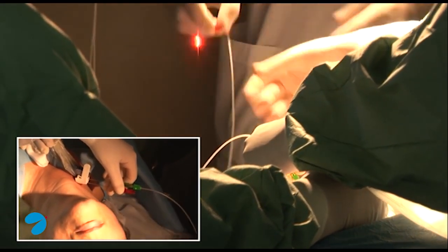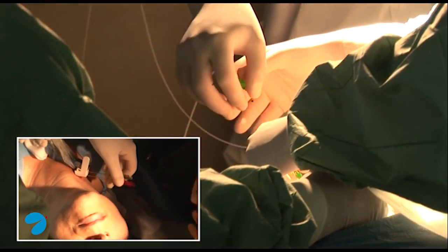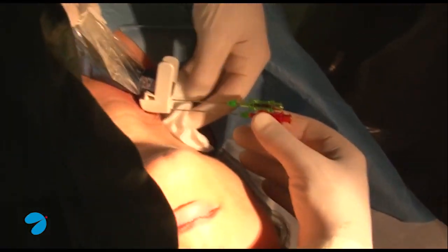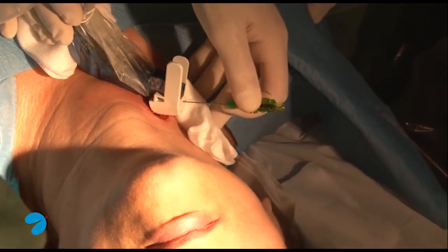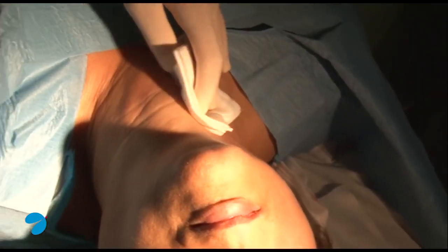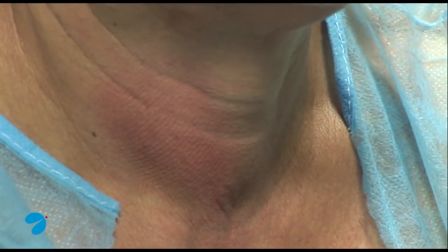We take out fibers, we remove needles. We apply a soft pressure to the patient's neck. We can see the absence of scars due to the treatment.